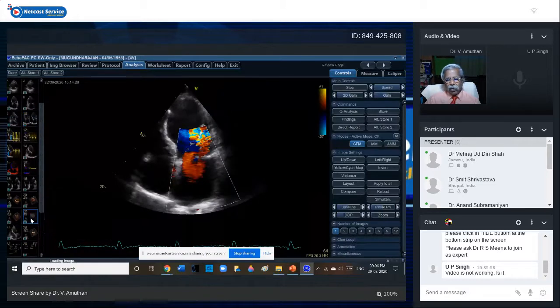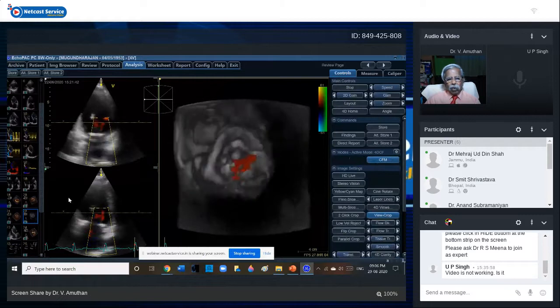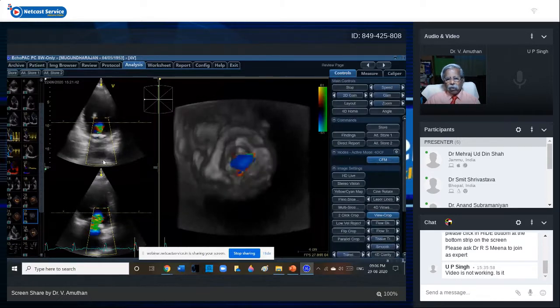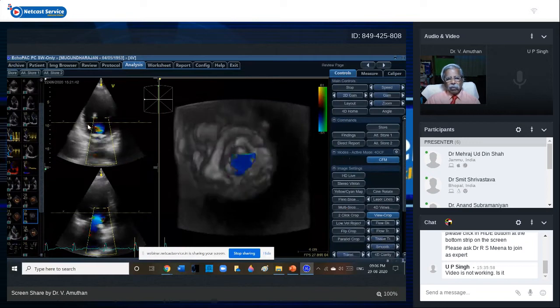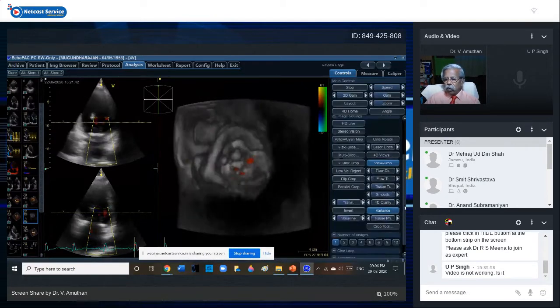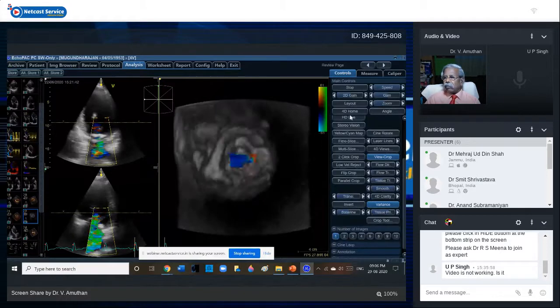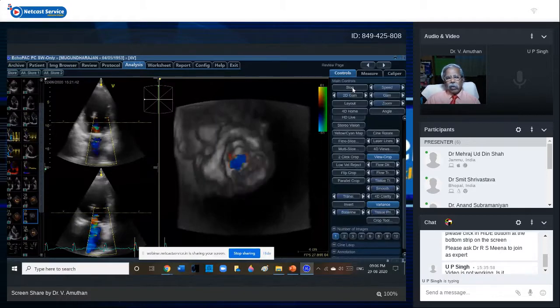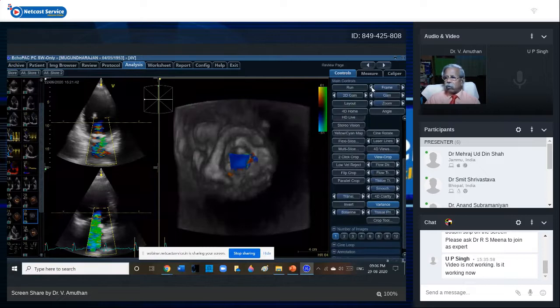This is the 3D mitral regurgitation. So now on the left-hand side you have the MR quantification software which is required for this. This is the cutting plane, also called the transverse line or cutting plane. When you want to do these things, the first thing is to stop it in systole, and then you can go for the procedure. So first, you can stop the aliasing.